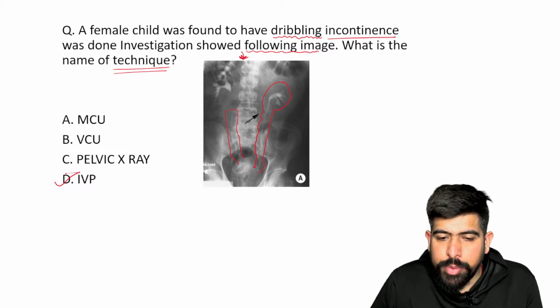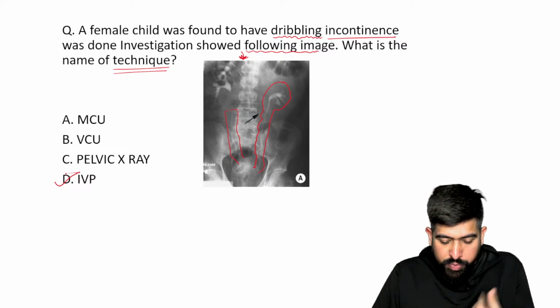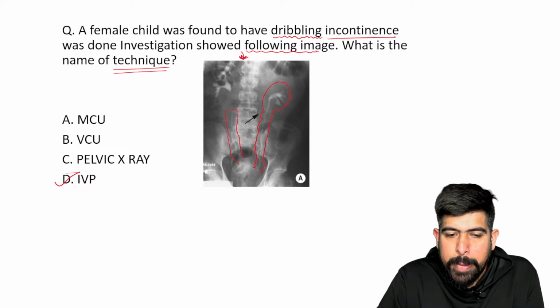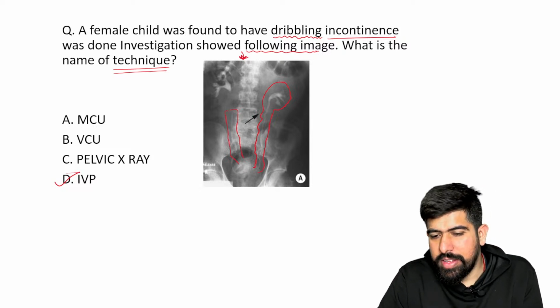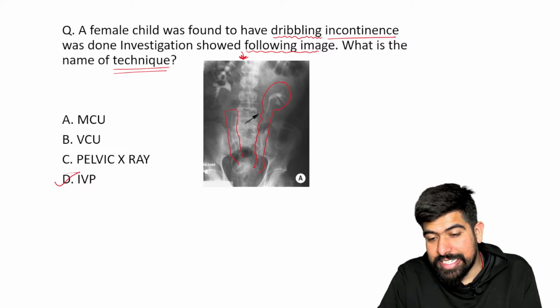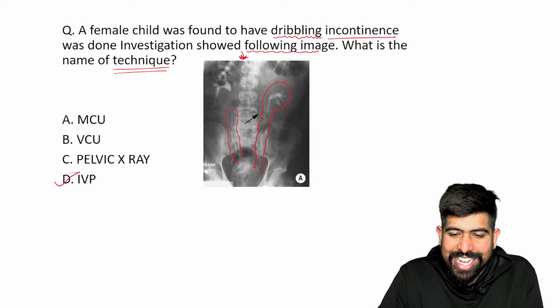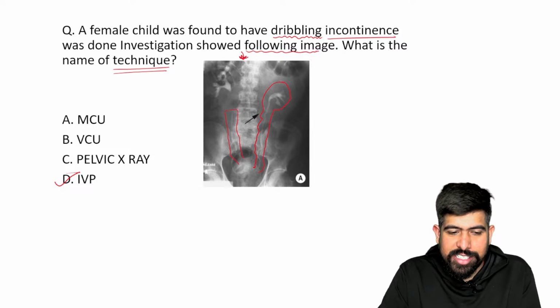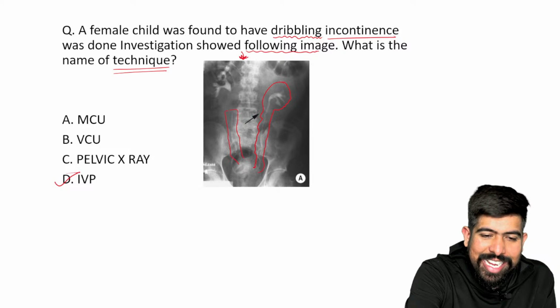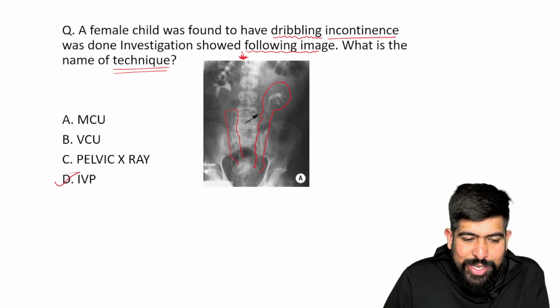Now I'm asking about it. What is your diagnosis for this patient? Okay, so the doctor here is confused again and saying yes, it's a drooping lily, and the diagnosis, the doctor is saying, is duplex of the ureter. Okay. Let's talk about it, doctors.